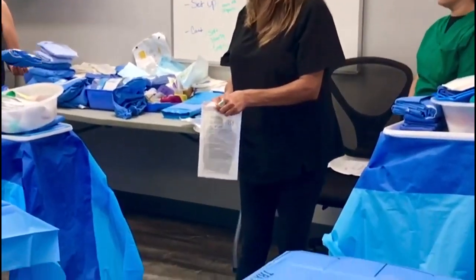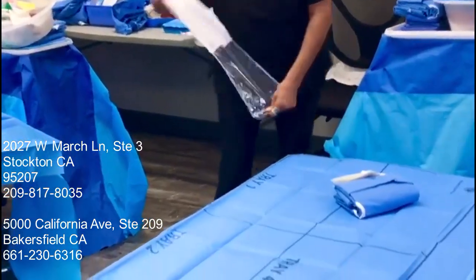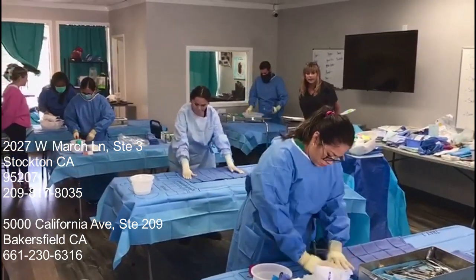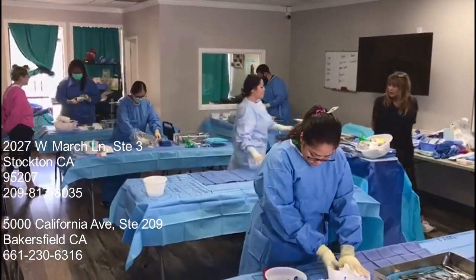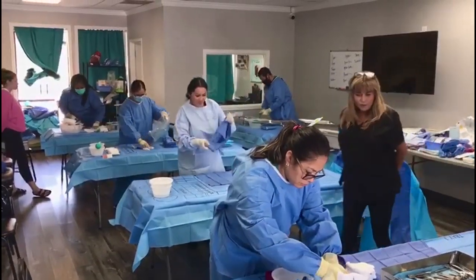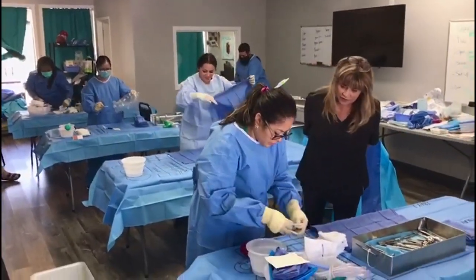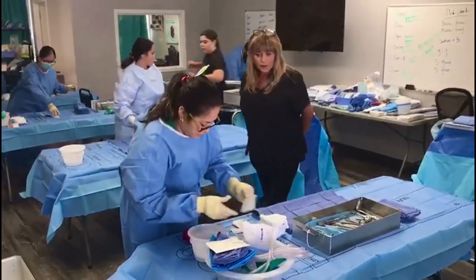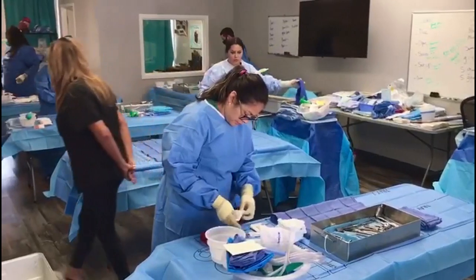You just contaminated the sterile — so we're not going to touch that, everybody. Does that diagram table make it easier for everybody? Make it a little easier for us to denote where things should go? A little bit faster setup for everybody? We know you love it.